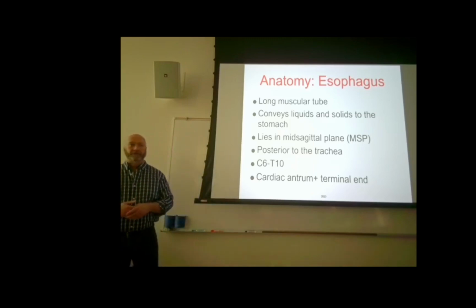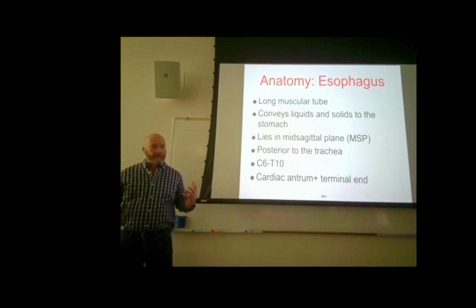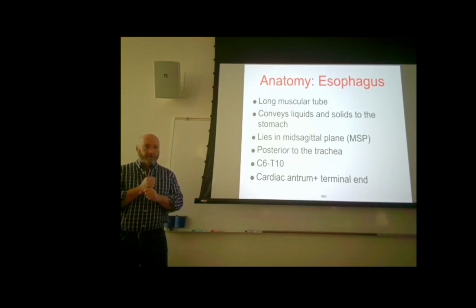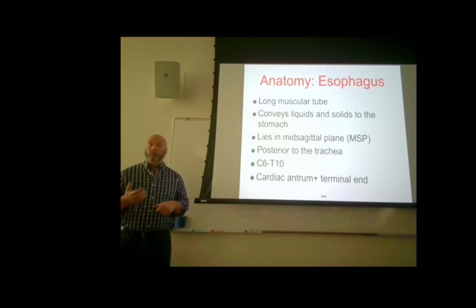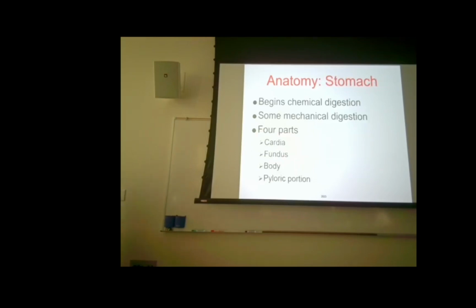But it's a very common condition. So the appearance, when we get into imaging, is a patient drinks barium, and what you see is a normal esophagus until it gets to the distal end, and it expands, and then immediately it goes real tight, right? That's what we refer to as the rat tail sign, for pretty obvious reasons. It's just a little bit of barium that flows through that distal portion into the stomach. So you may see that in either the reporting or in your textbook.